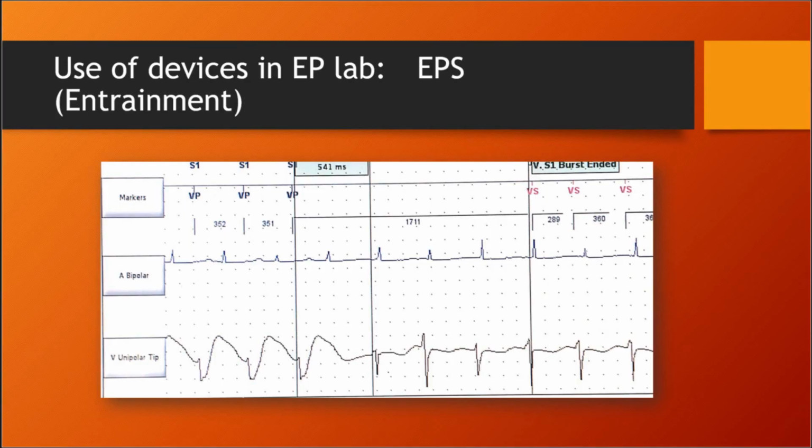This is a great example of getting some really sophisticated EPS and making a clear diagnosis using an already implanted dual chamber device, without risking the patient or risking the team in this case of going through an invasive procedure just to discover what the patient actually had. Now, we followed this with a typical AVNRT ablation, which ended up being a really simple procedure, and based on the information we already have from her pacemaker, we successfully diagnosed and we carried out an ablation procedure with minimum risk for the patient and for the team.